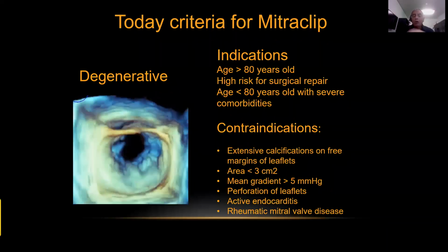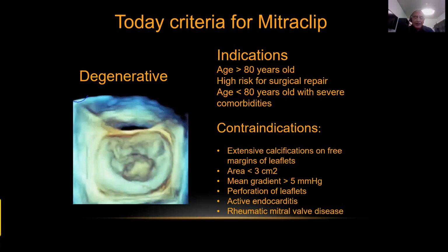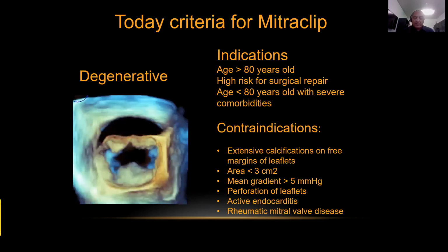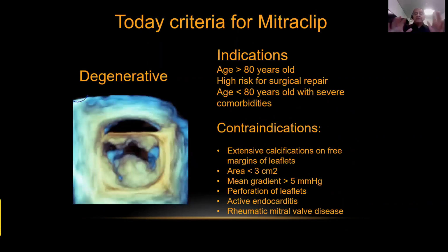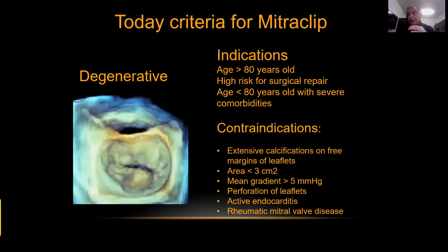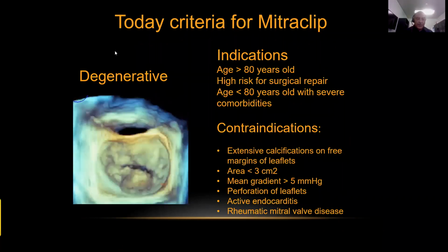Or perforation of the leaflets. Of course, we cannot put the MitraClip when the leaflet is perforated, or if you have endocarditis or rheumatic mitral valve disease. These are our contraindications. We can discuss them more afterwards.